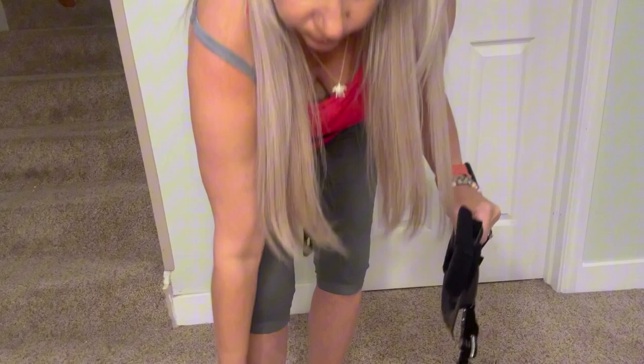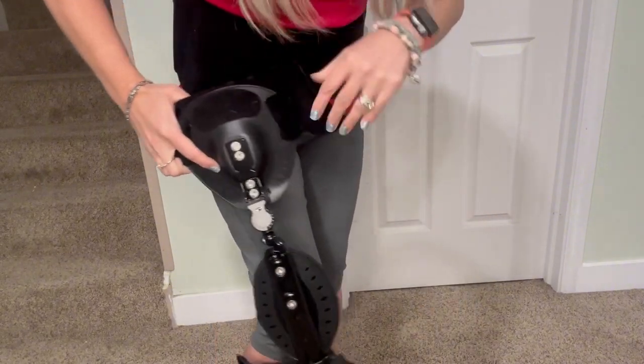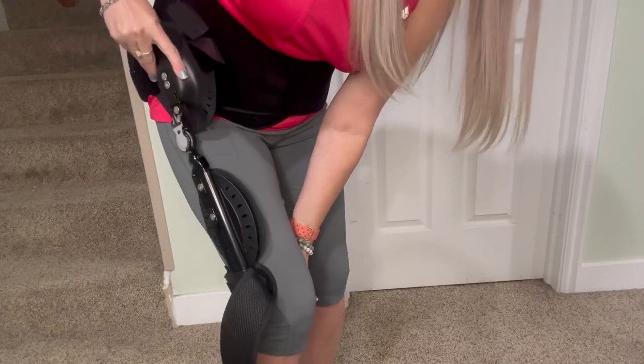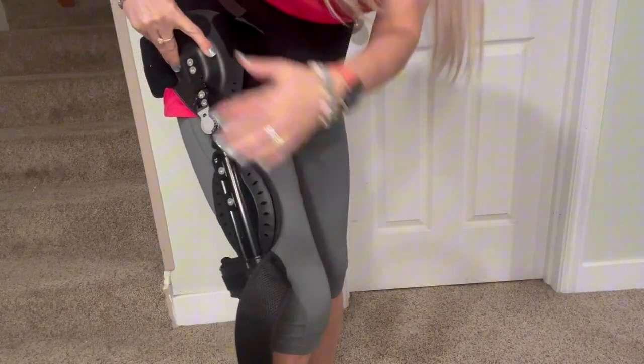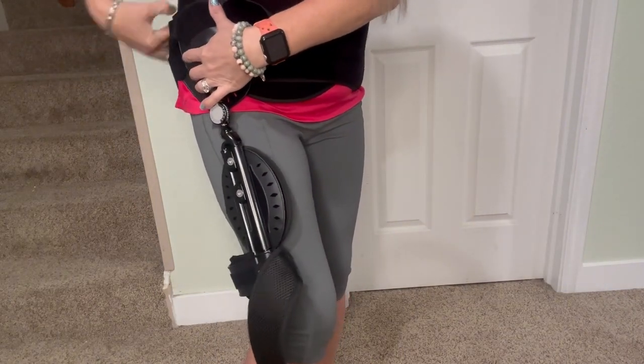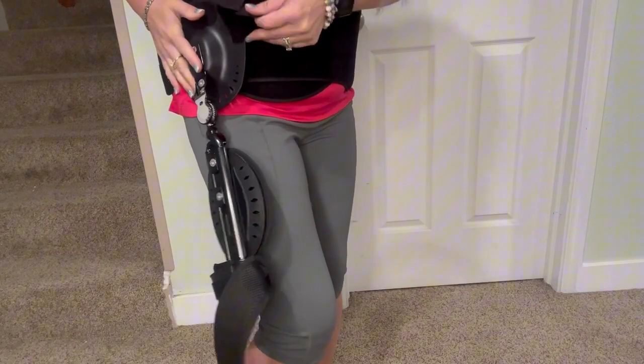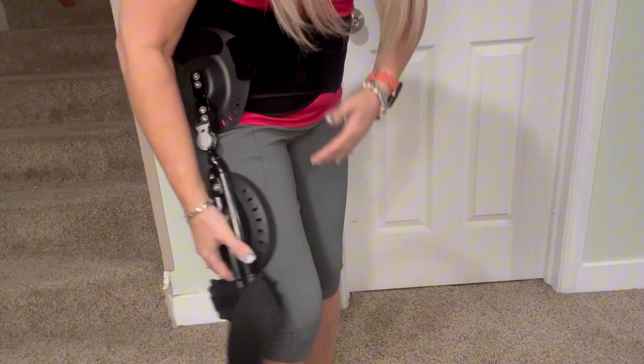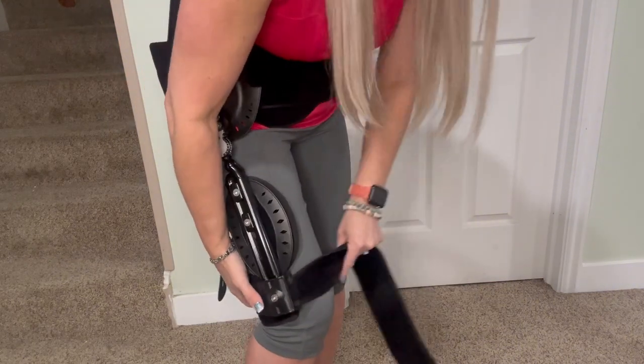Once you put the waistband on, you start to work on the leg portion. It does come with a tool so you can make any adjustments as necessary. It's very easy to put on — you just attach the top part to the band itself and then put the bottom part around your knee.